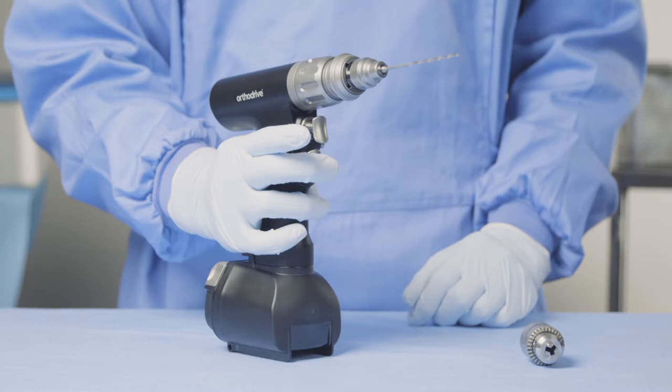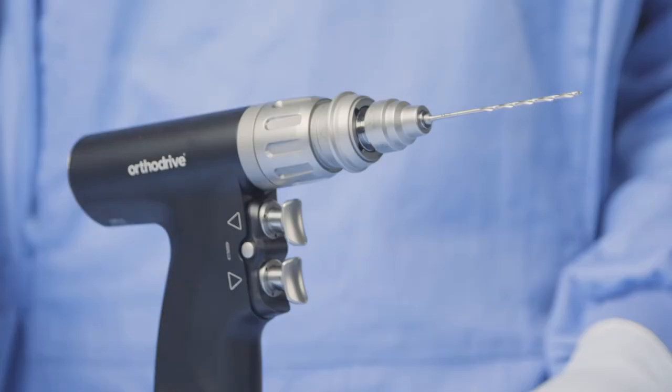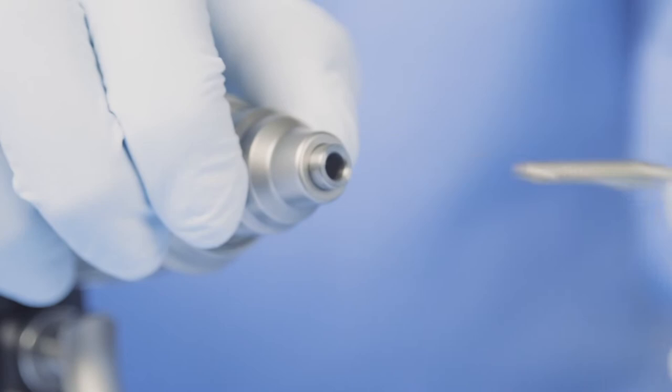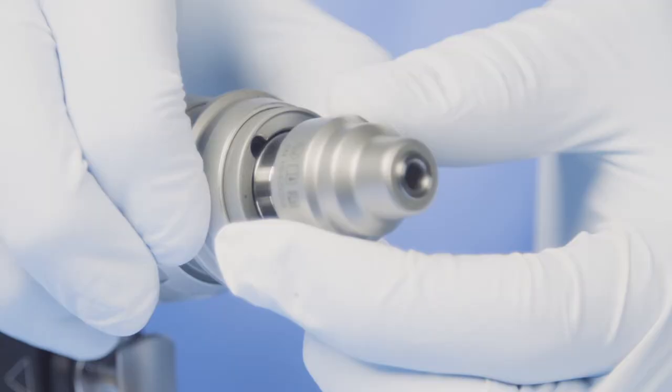and use the drill. To remove the drill bit, place the tool back into safe mode, pull back on the collar once again, and slide the drill bit straight out. To remove the attachment, again, pull back on the collar and slide straight out.